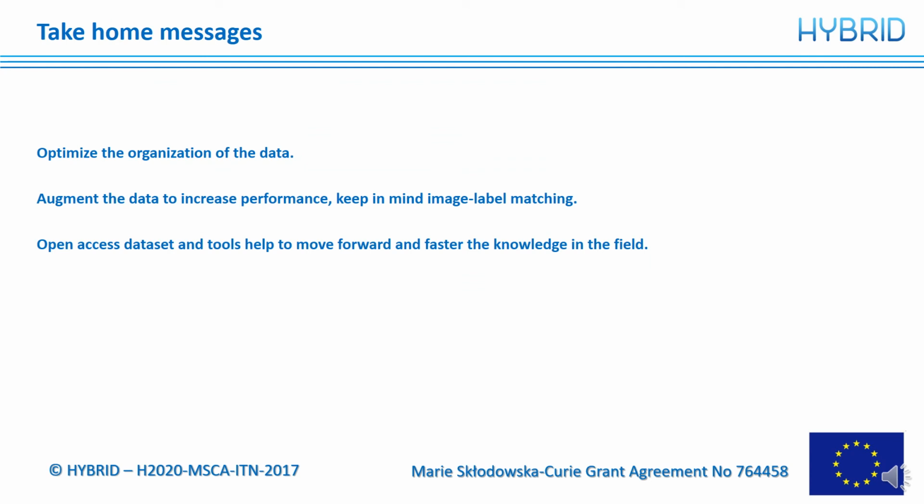To conclude, I would like to leave some messages. Beyond all of the tips, tricks, and suggestions you can find on different websites, blogs, on the internet, and in the literature, I would like to highlight that the optimization of data organization is crucial. This was one of the main time-consuming tasks because I needed to match the exact position of the mask with each input image.